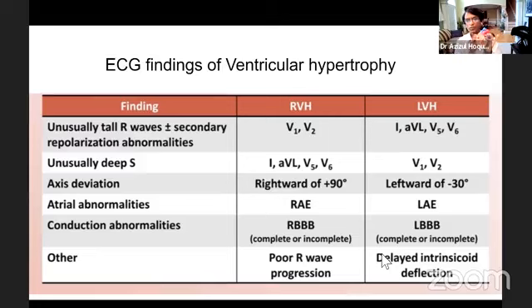Because if it is pulmonary stenosis, what's the effect going to be? Blood cannot flow to the lungs. The pressure on the right ventricle will be higher, right? And that can be reflected in the right ventricular thickness, and in the long term also in right atrial enlargement. Like tetralogy of Fallot, right? The main problem is on the right side, so thickening of the right ventricle is going to happen. If you think in a three-dimensional way and keep that in mind, then you don't have to memorize the causes. And this is clinically very important. When you see the ECG, also put in your mind what the potential causes could be. So, thank you.